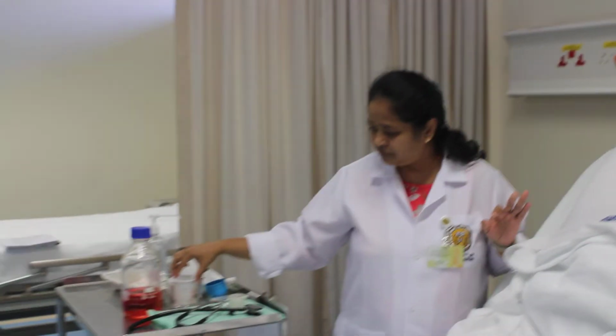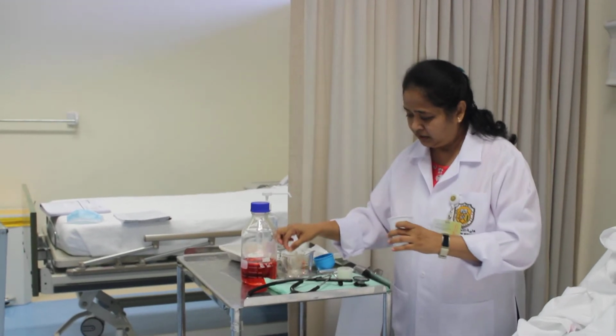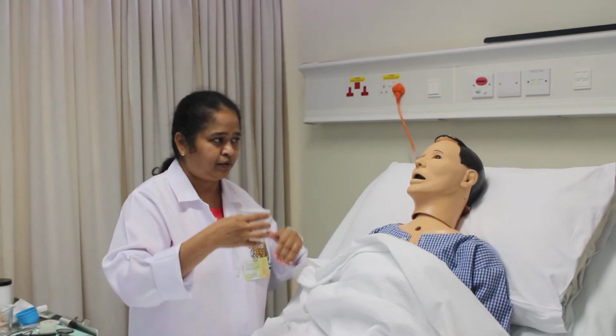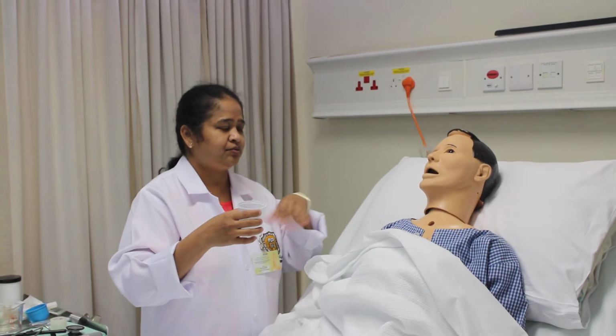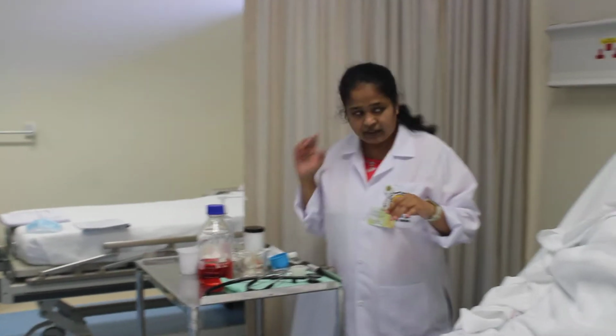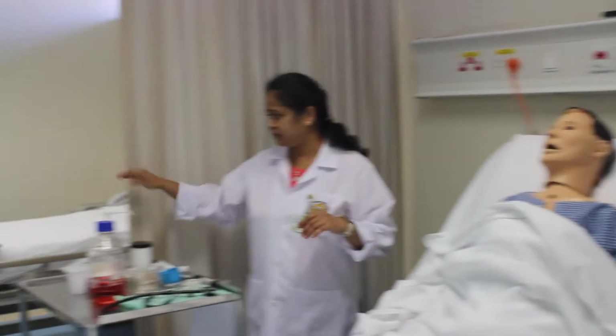I have kept water for you. In between, when you want to drink and swallow, it will help us to put the tube inside very easily. Okay, you can ask me. Of course I need my gloves.